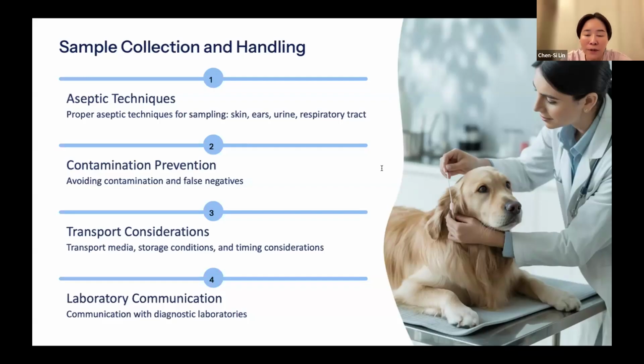So as I mentioned, if we leave respiratory samples too long at room temperature, they may lose their viability, leading to false negative results. So ideally, samples should be processed within a few hours. It's very important to do so within a few hours.